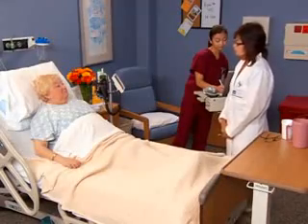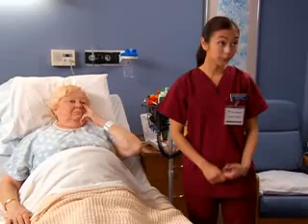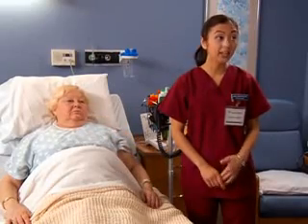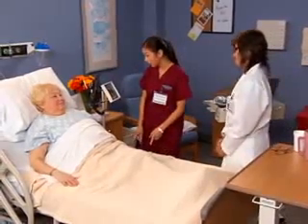Impressive. Rose, did you assess the patient for respiratory distress, retractions, nasal flaring, grunting? Yes, regular rhythm and depth. And if the respirations are unusual in any way, then I would count the respirations for at least a full minute. All right, excellent. Okay, now we'll take your blood pressure.